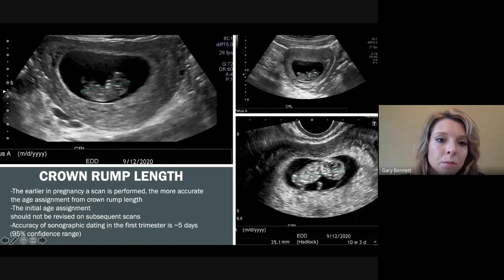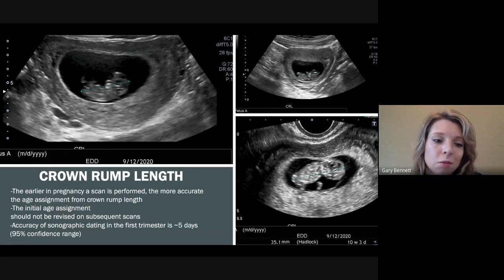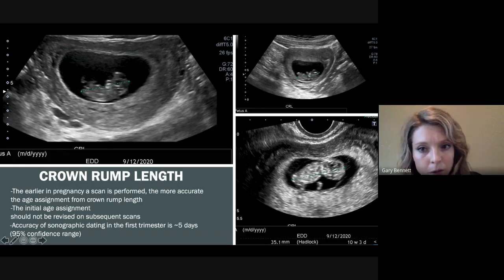So coming back here, we have baby's head. You can kind of see a profile right here. A leg, that might be a cord there. We just want to make sure, of course, you're stretched all the way out, coming all the way from the head to the rump, to get that nice measurement there. I usually take 3 and take an average, but they're almost always the exact same measurement 3 times.